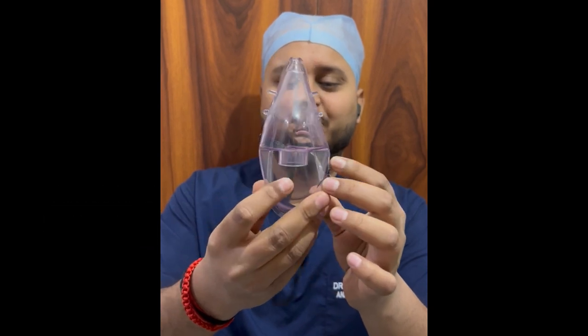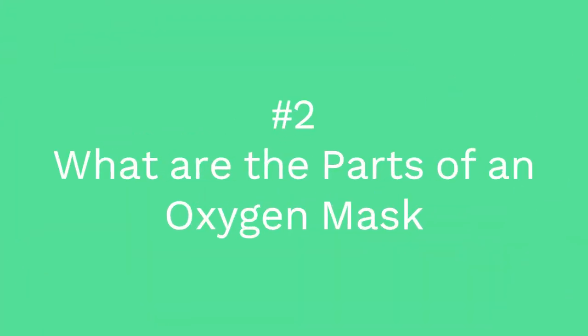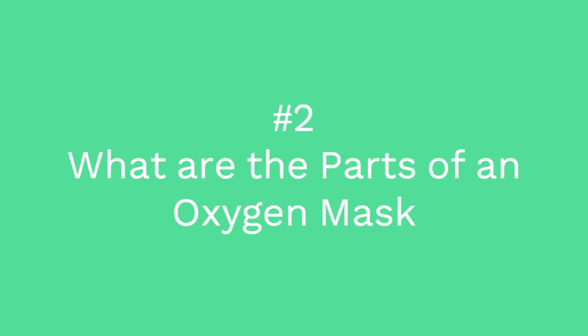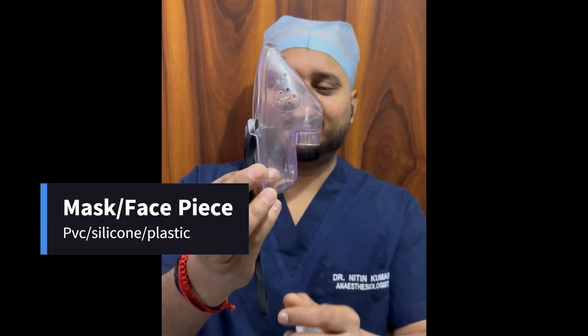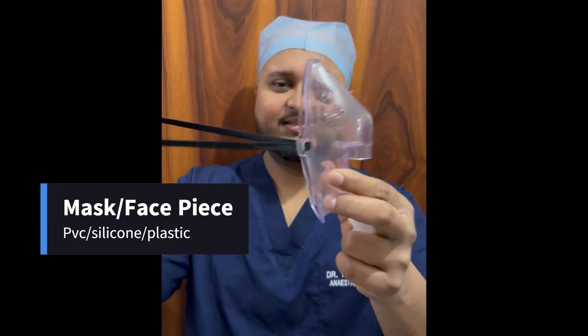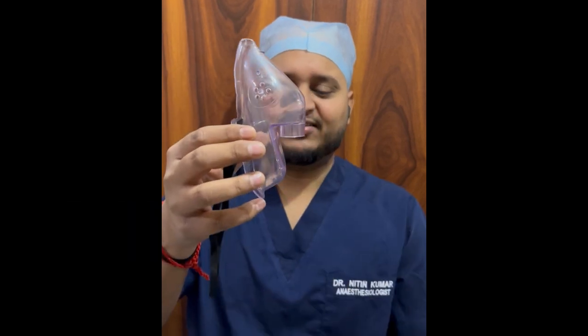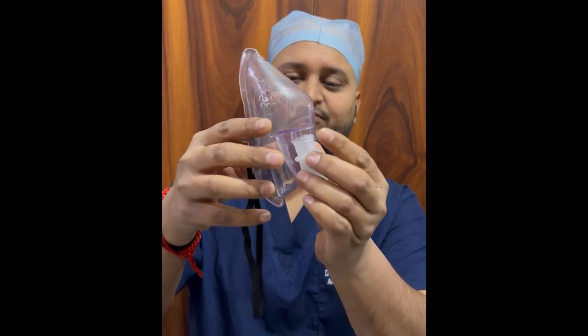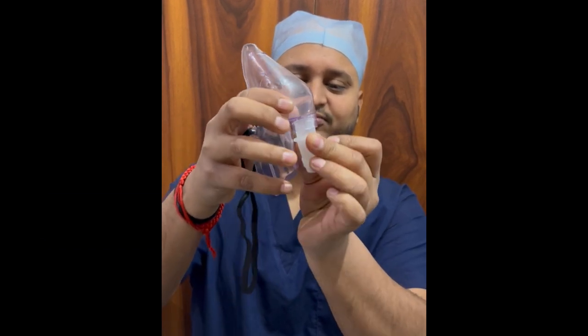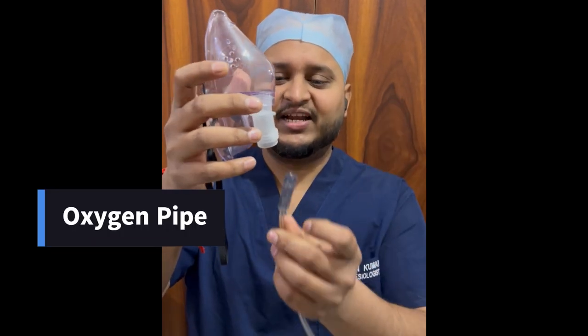This oxygen mask has basically three parts. First is the mask itself — it has a band. Second, a connector which is connected to this part of the oxygen mask. Third is an oxygen pipe which is connected to this part.